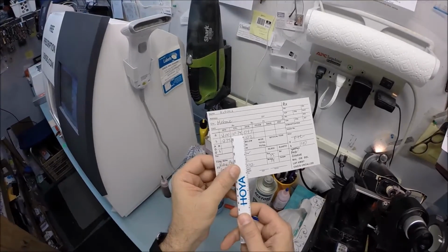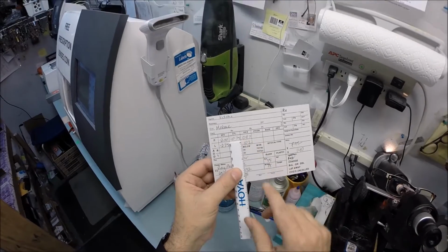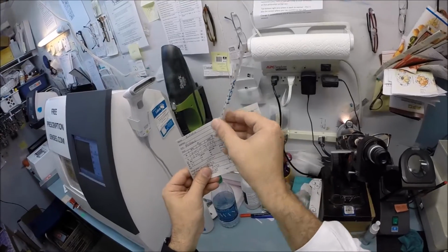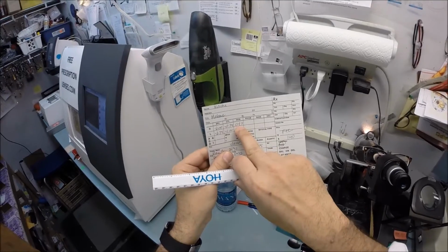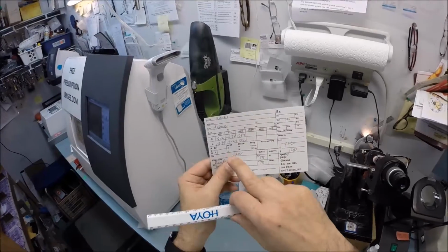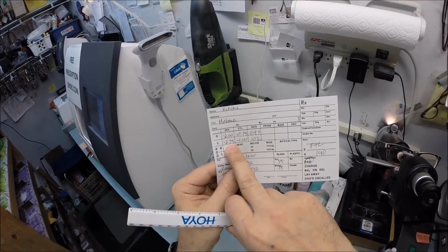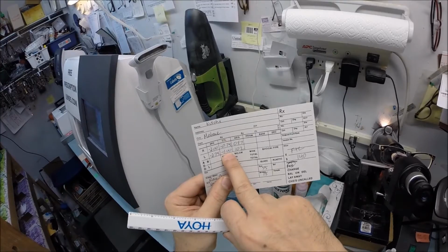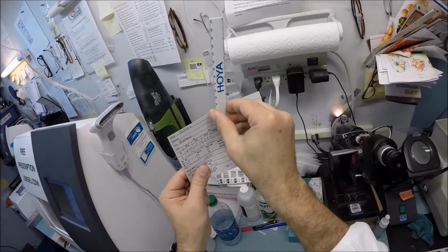Okay, and so think of the astigmatism correction as the fine-tune knob. We're going to turn that fine-tune knob to 97. A straight line is 0 to 180. So 0, 90, and 180. That's where we're going to turn that knob, if you can imagine this being a knob. So we're going to turn that fine-tune knob of 3 steps to 97. So we're just past 90 to about 97. Your left eye needs a little bit more correction. You actually need 11 steps of minification for your nearsightedness. You need 4 steps of correction for your astigmatism. And we're going to turn that fine-tune knob to 102, just beyond the 97 to 102.